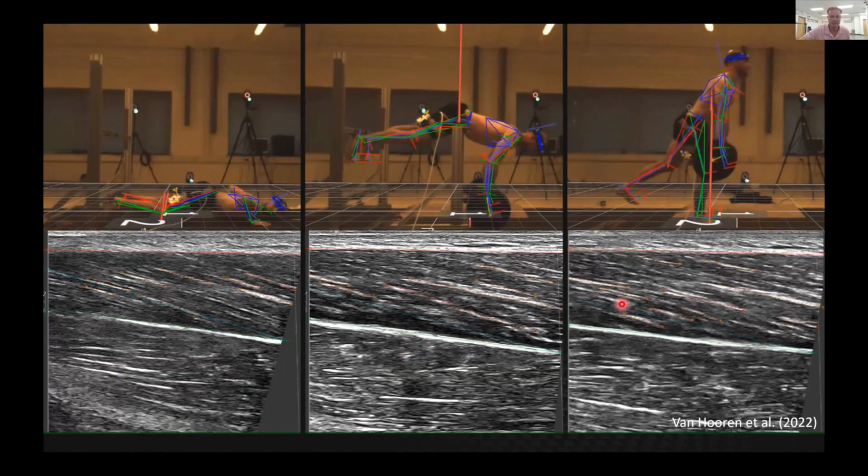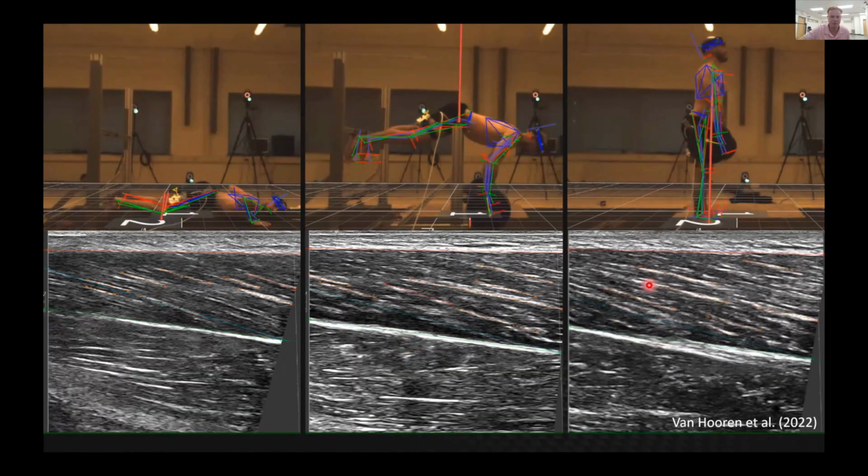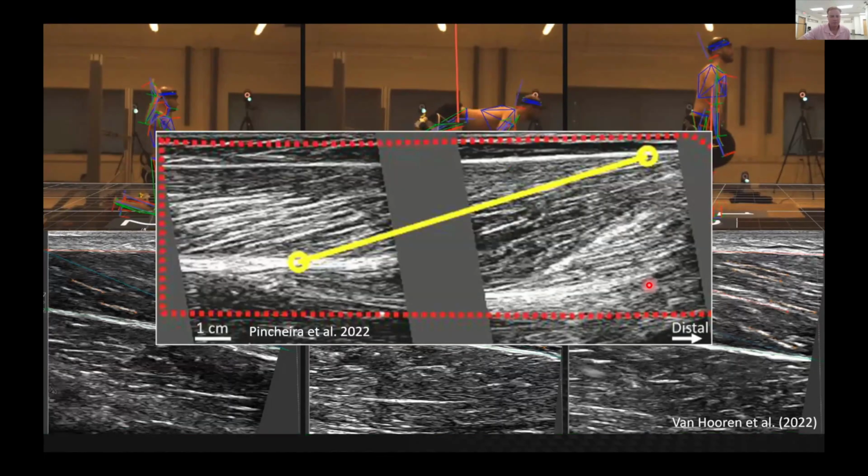So again, over biceps femoris, so over hamstring muscle there through those movements. And for a muscle like biceps fem, where you might have these really long fascicles with quite small pennation angles, we might elect to use two ultrasound probes in series with one another so that when it comes to tracking fascicles, we have visual of the insertion and origin of the fascicle rather than just relying on some sort of extrapolation. So we're going to talk about these automated methods on the next slide.